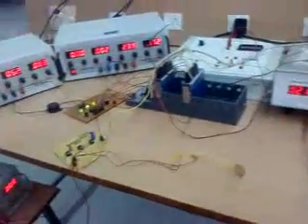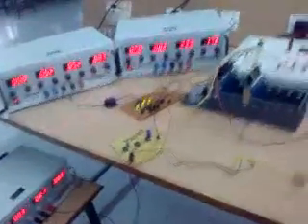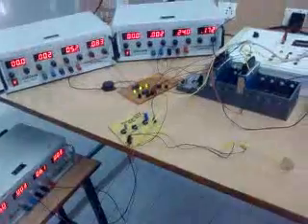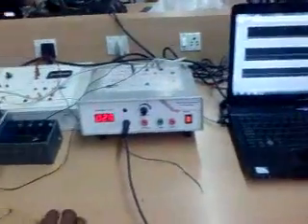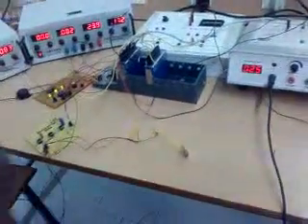So we have designed a monitor which detects apnea and gives a signal to the doctor or the physician so that he can save the child or save the person in sleep. So this is the setup.